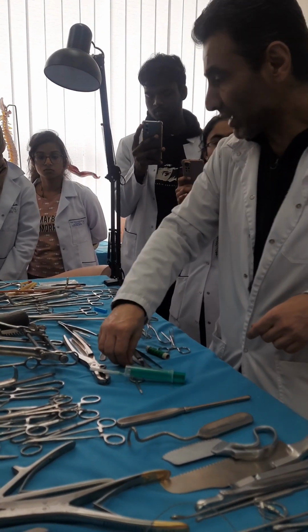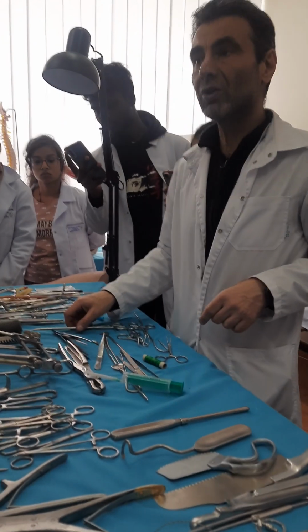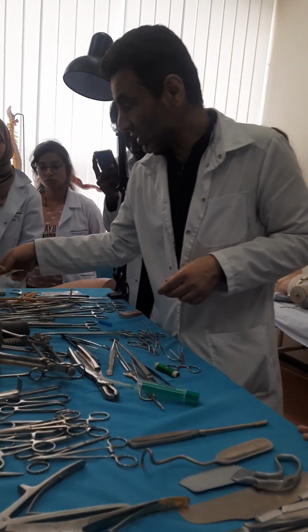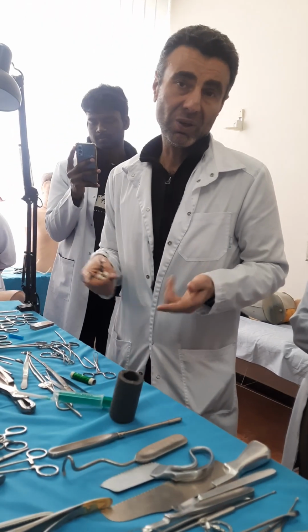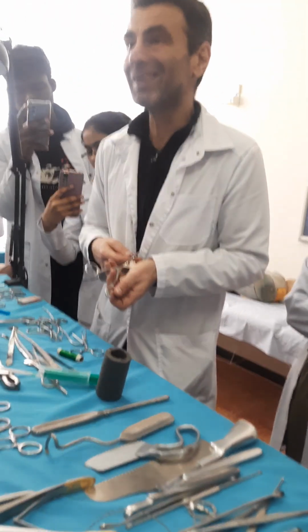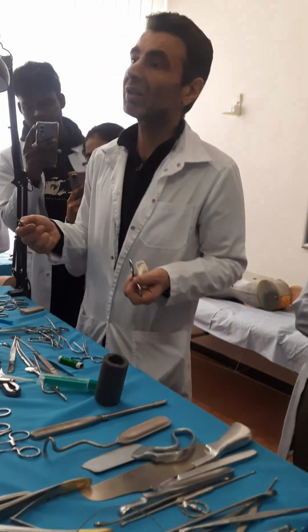Okay, let's come to group number 4. As you remember, we call it special surgical. Special, for example, in this example of 3 instruments, let's understand what is the specificity of them. Special means each instrument has only one purpose. For example, these 3 instruments are created for tracheotomy, tracheostomy. We call it the tracheotomy set.